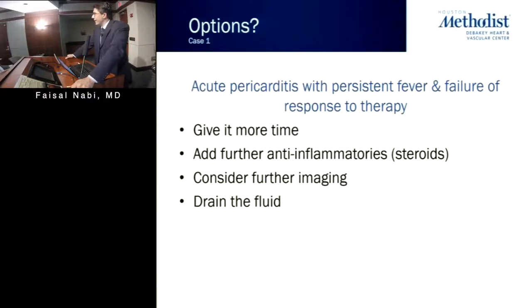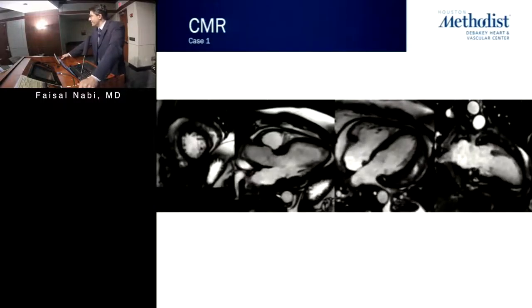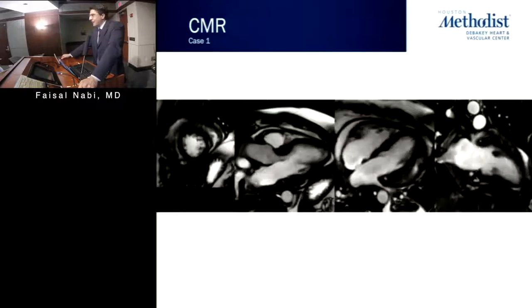Would you consider now adding further anti-inflammatories? Would you consider further imaging to figure out what's going on? Or would you simply now take this patient and go ahead and tap the fluid and see what's going on? So, this is an imaging talk, and you're absolutely right. I can tell you, we went ahead and proceeded with a cardiac MRI, but hopefully in the next few slides, I'll show you why.